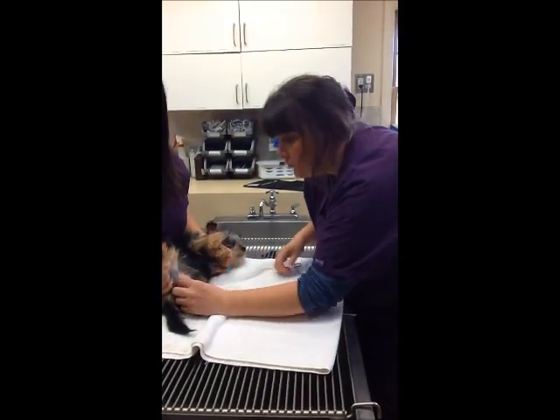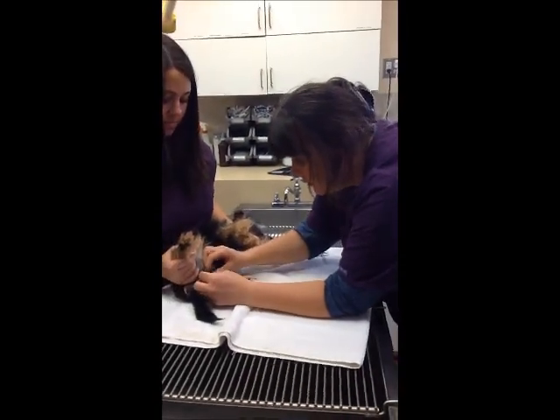This is what it looked like before. This is what it looks like after it has been autoclaved. And the desired temperature, in this case was 250 degrees, has been reached for sterilization. And everything is labeled, has 6 months expiration date on it, and has initials. We'll do suture removal on a neuter.